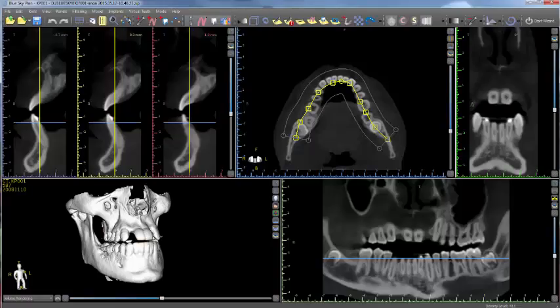This tutorial will contain basic and additional information about manipulating the panoramic curve. When a CT scan is loaded into BlueSkyPlan, the software automatically draws the relevant panoramic curves to the case.